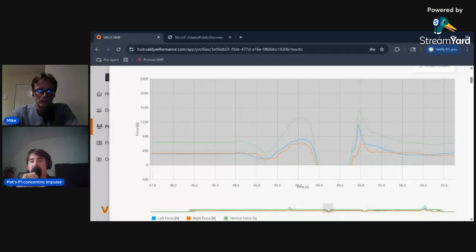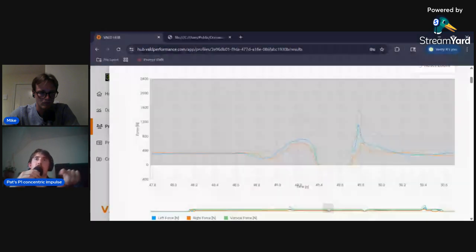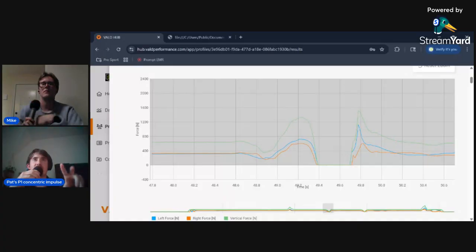And then honestly, from that point, are we able to retest every session to see are we making change? I do not want to cue someone while doing the test or on the force curves necessarily.